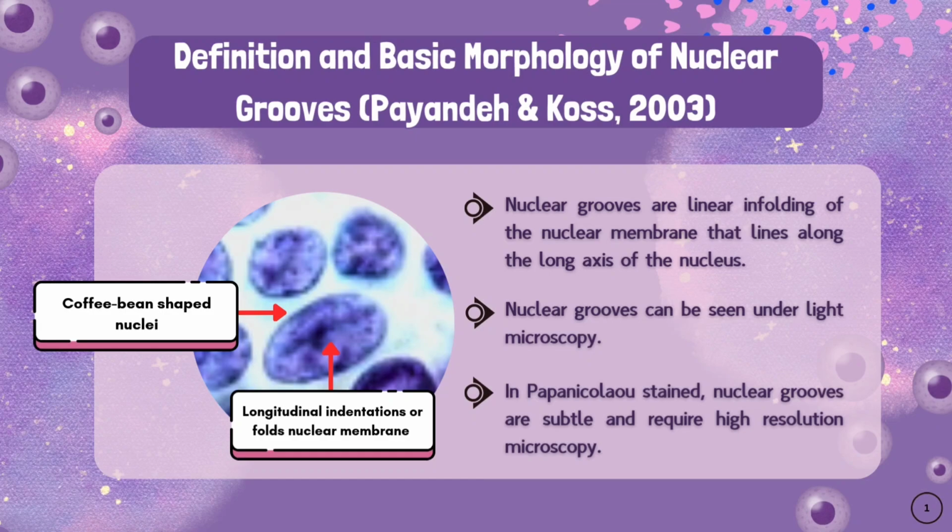Third, in Papanicolaou-stained cervical smears, nuclear grooves are subtle and require high-resolution microscopy, which is the 40 times objective, for detection of the groove.